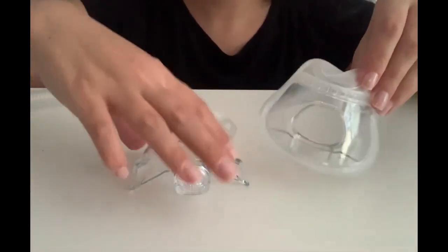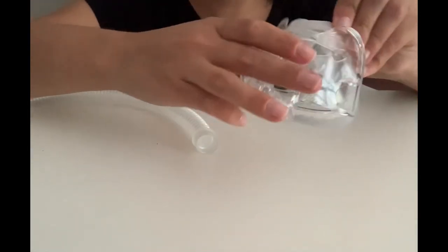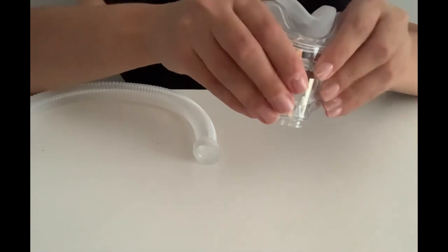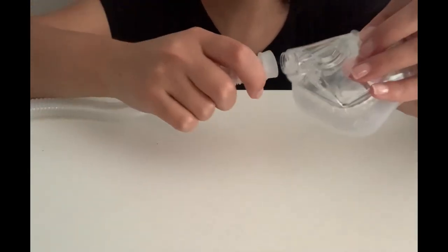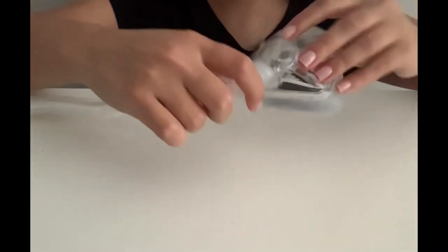To reassemble, first grab the cushion and frame and reattach them to each other by pushing them in. Put your tube back in the frame by pushing it in and you'll hear a little click.